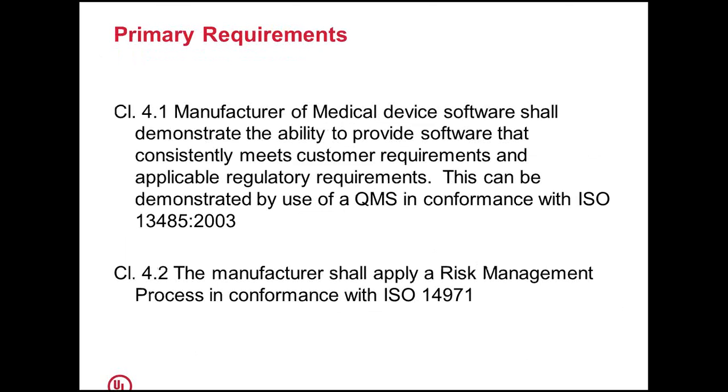The primary requirement from the 62304 standard clearly specifies the manufacturer of the device shall demonstrate the ability to provide software that consistently meets customer requirements and applicable regulatory requirements.